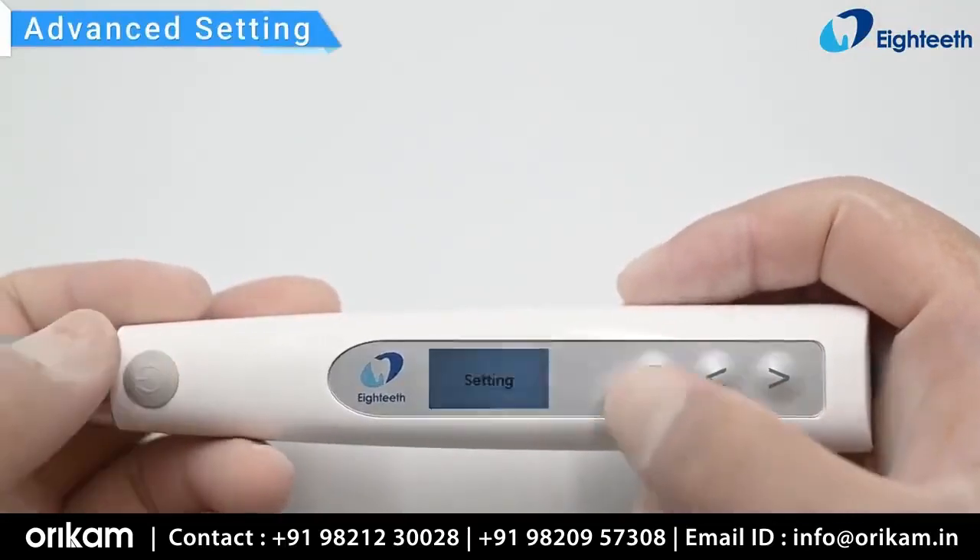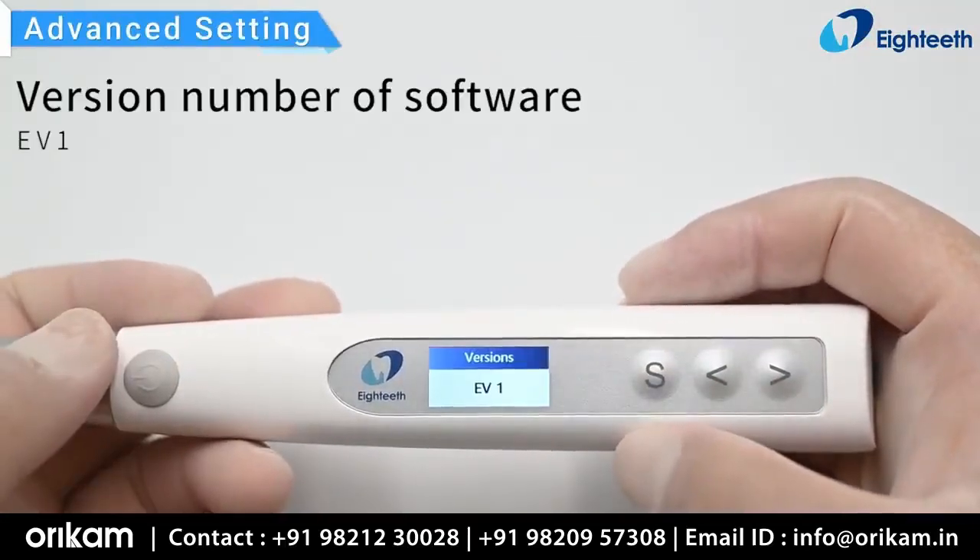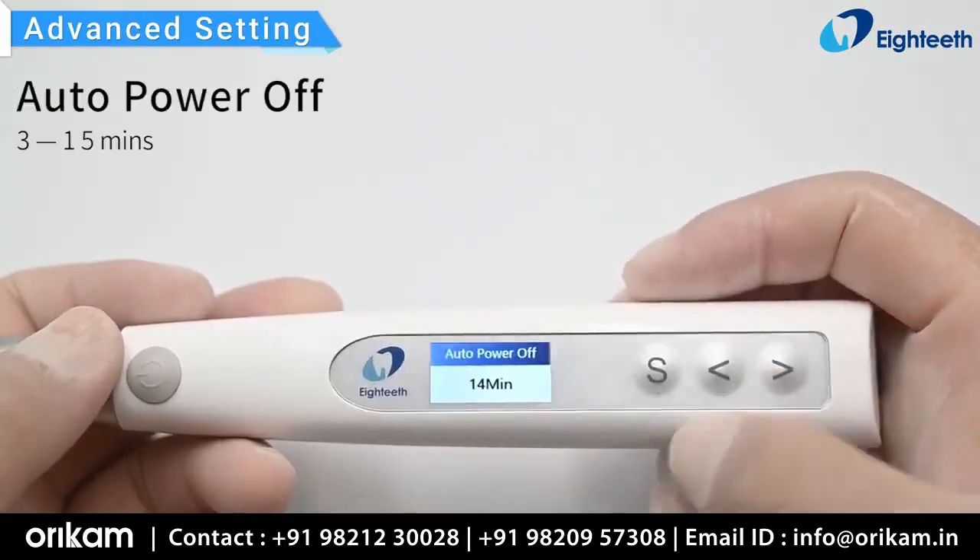During the power-off state, hold down the setting button, then press the main switch to enter the advanced settings.